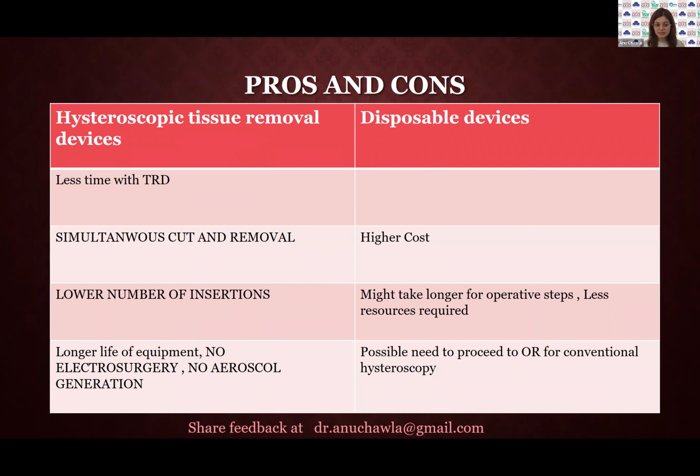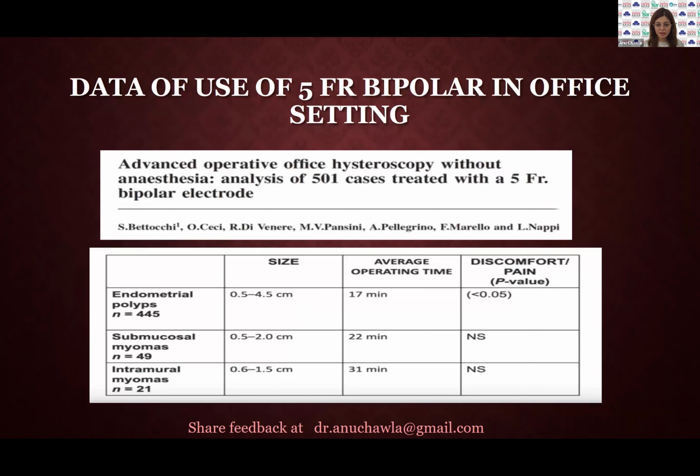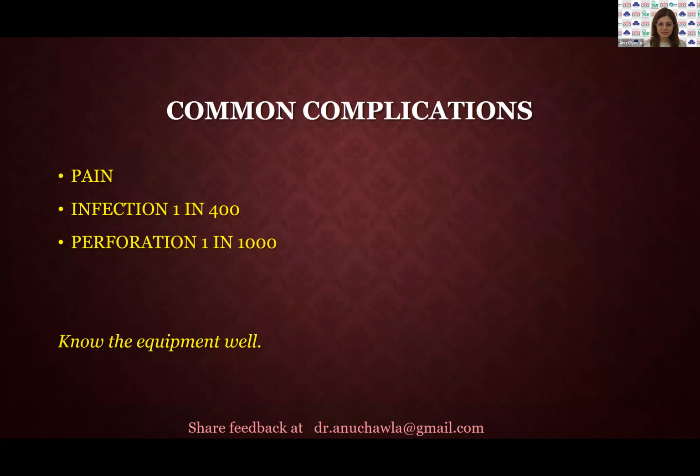These are the differences. This is a study which is actually not done by anybody else and only done by Stefano Bertocci, which is actually based on the pain score. And the results are very encouraging that if gentleness is the parameter followed, and if the surgeon is skilled, then pain will not stop you in most cases.